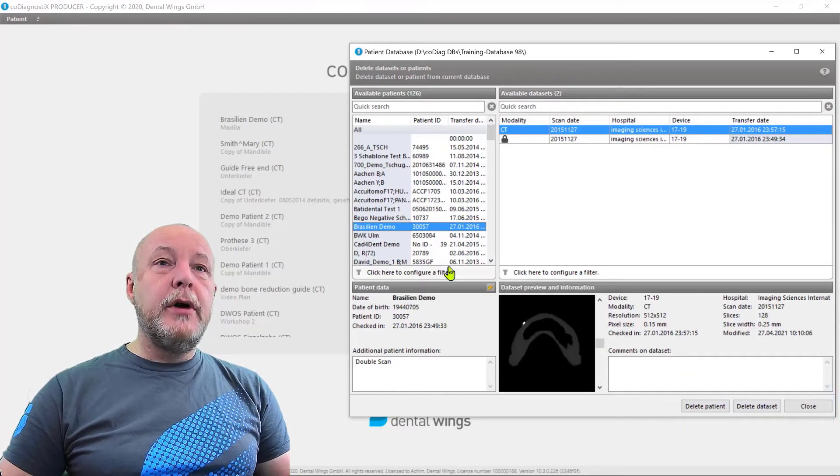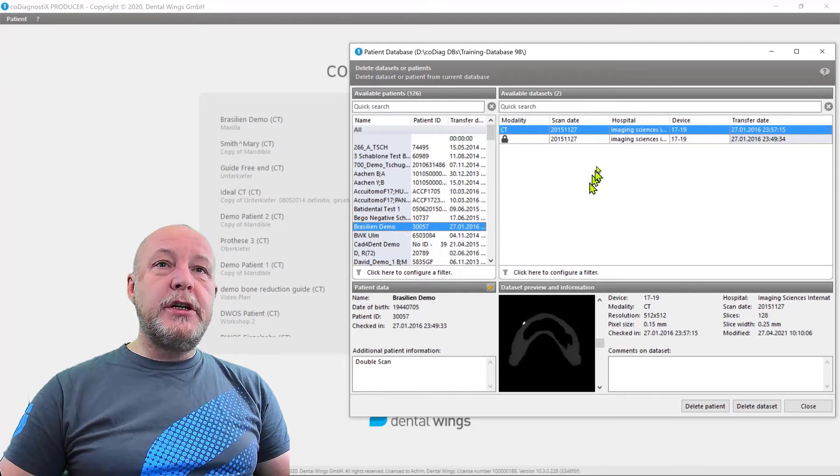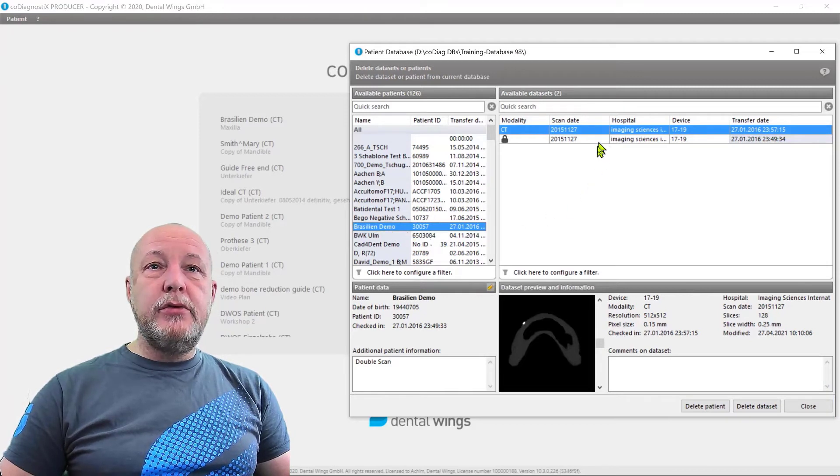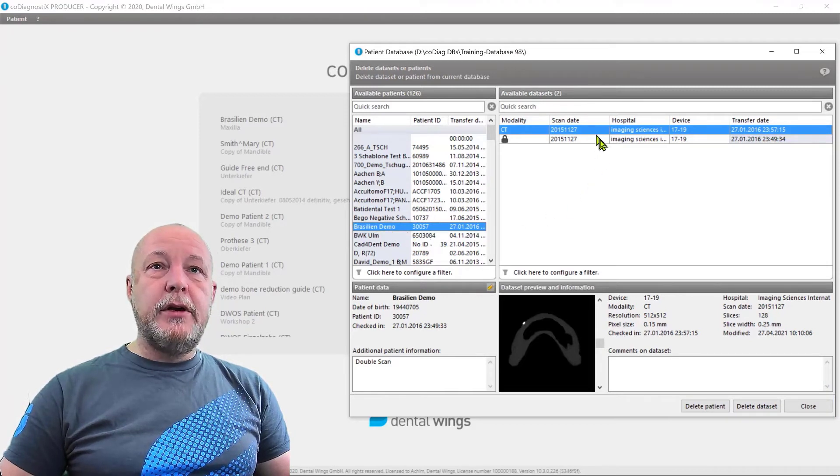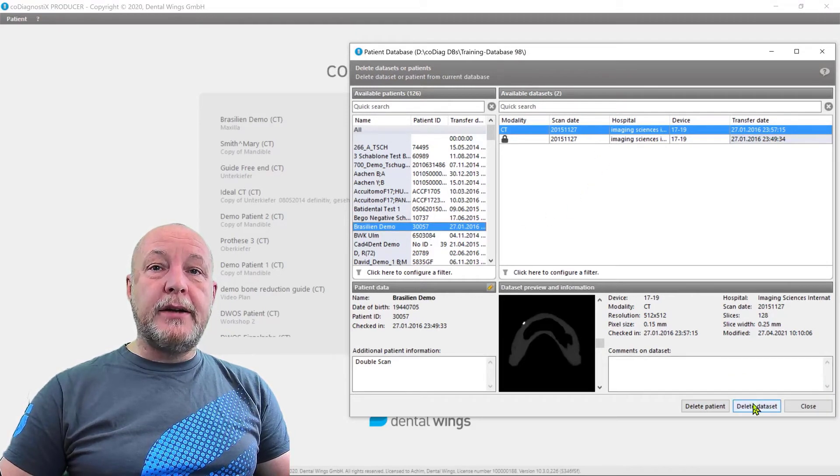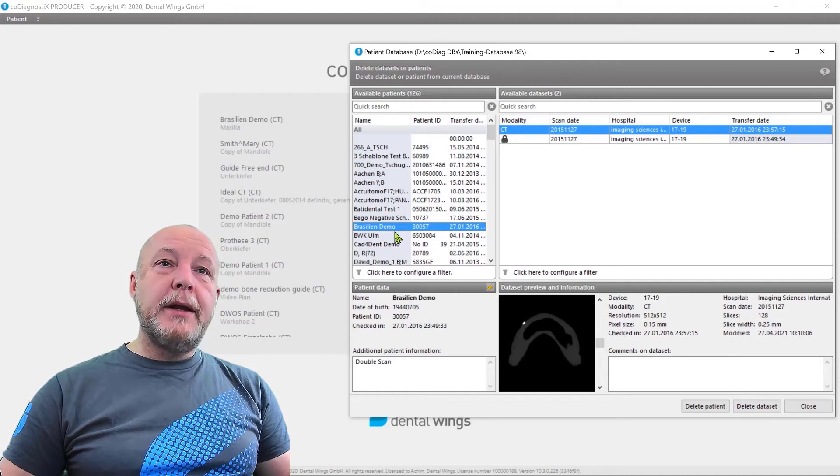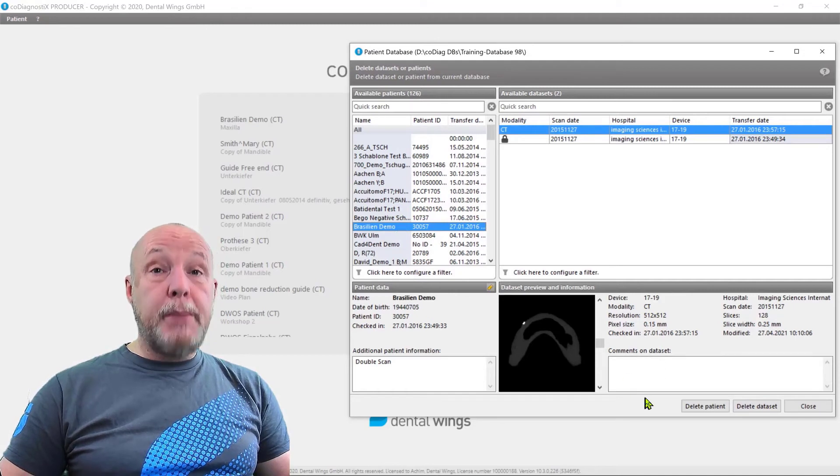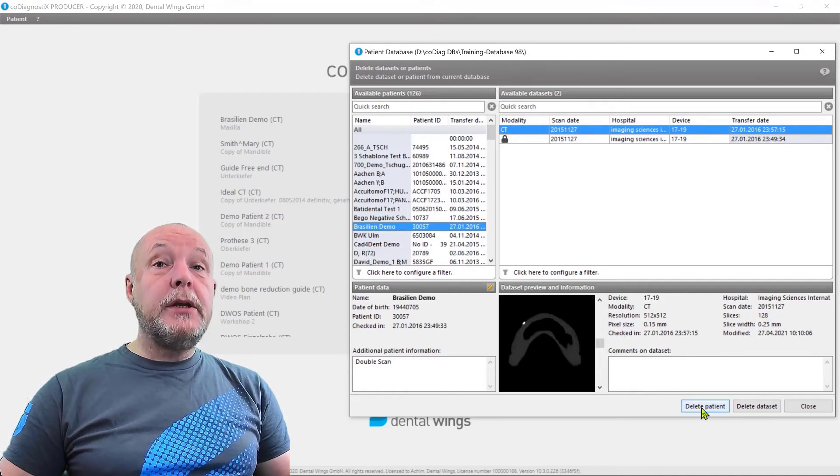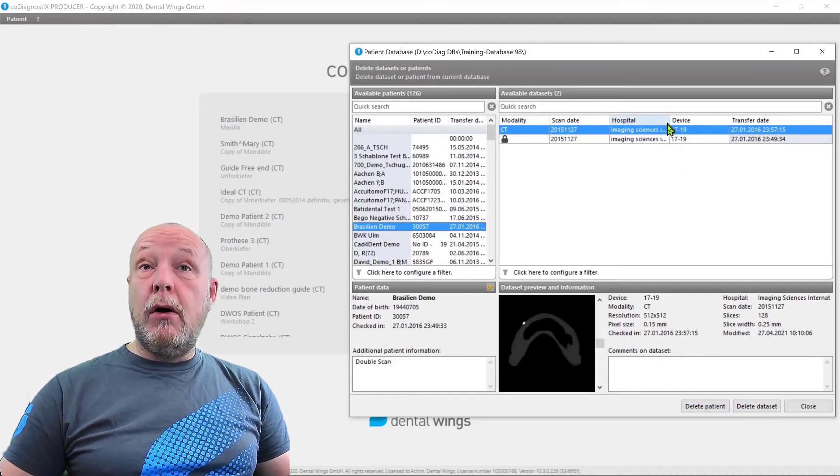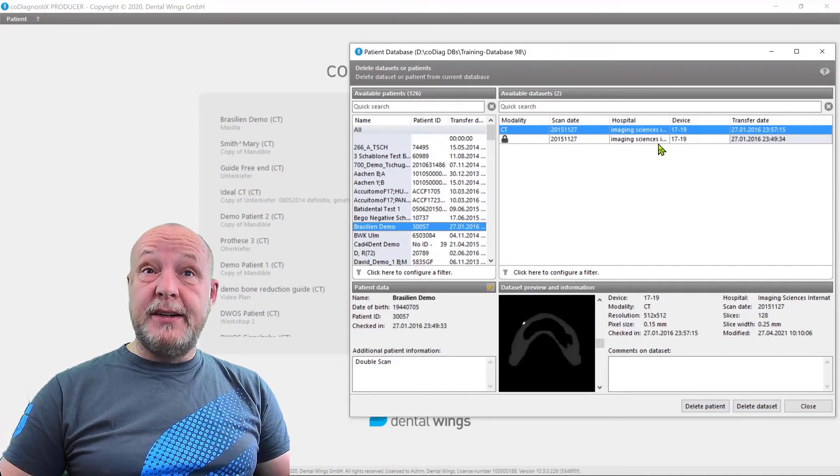This is a difference. So this patient here has two data sets. So if I delete the data set, I keep the patient. But if you delete the patient, you delete all of his data sets.